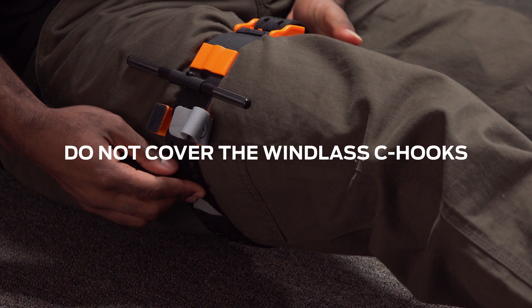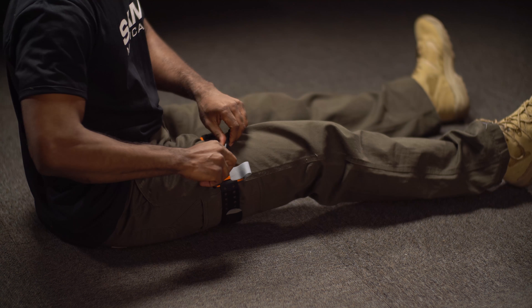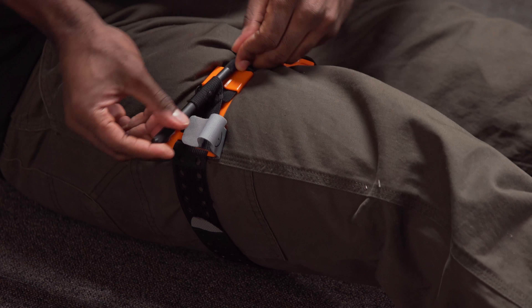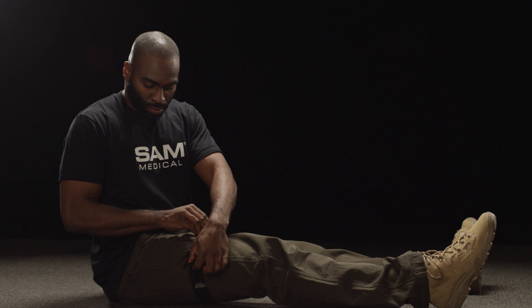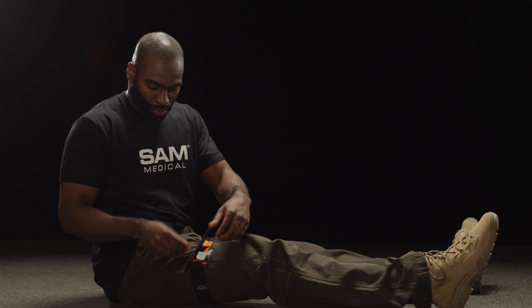Do not cover the windless C-hooks. Twist the metal windless rod until the bleeding stops. Secure the rod inside the windless C-hook and confirm that bleeding has stopped. If bleeding persists, tighten the Sam XT with additional twists of the windless.